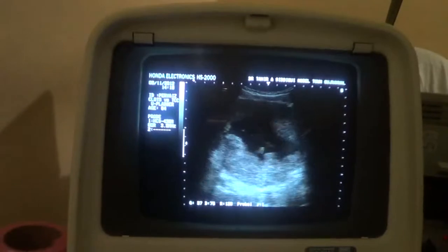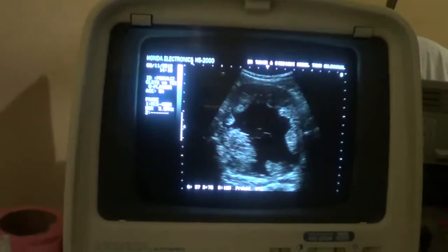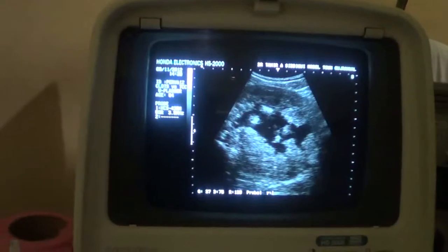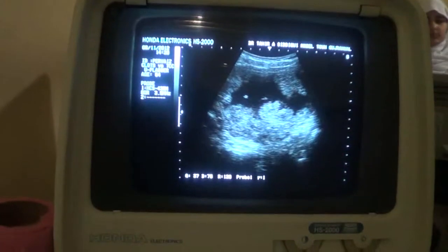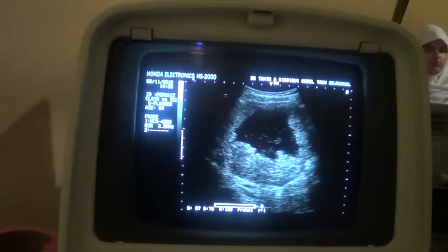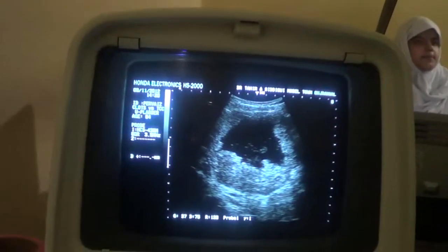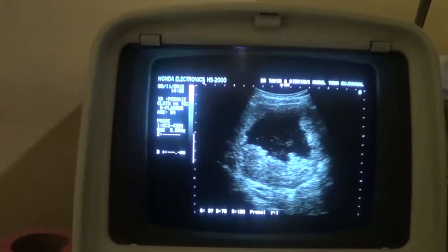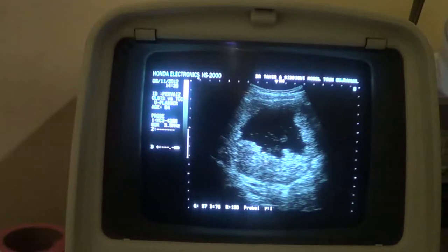Now this is the transverse view. In the transverse view, you see hardly any segment of the urinary bladder, including the medial wall, lateral wall, and posterior wall, spared of these echogenic areas, except the anterior part of the anterior wall. This is the anterior wall of the urinary bladder in transverse section. This is the lumen of the urinary bladder with the tiny echogenicities that you can see, that is the debris, and this is the thick layer fixed with the wall.